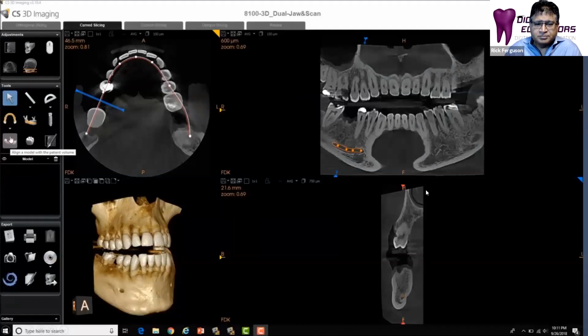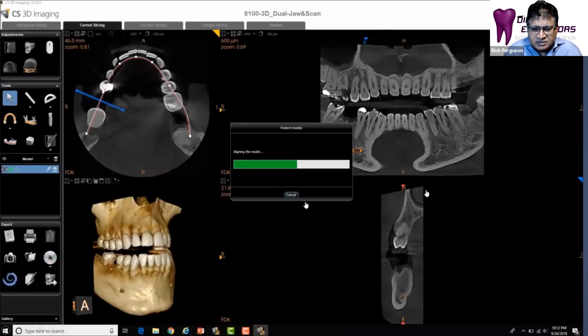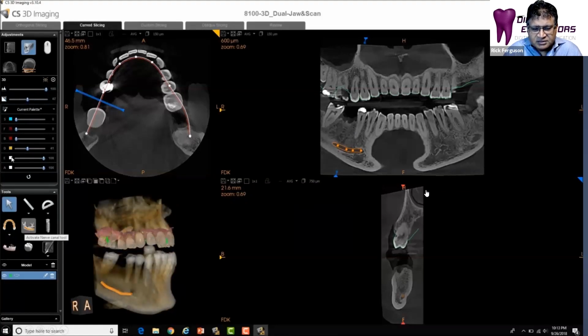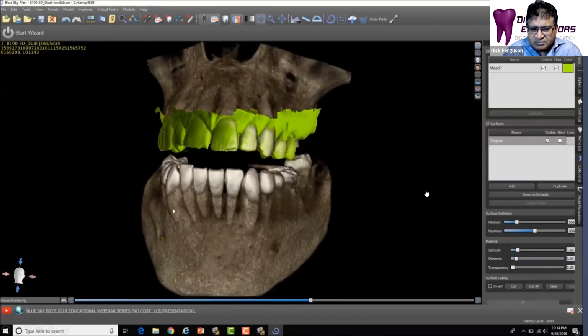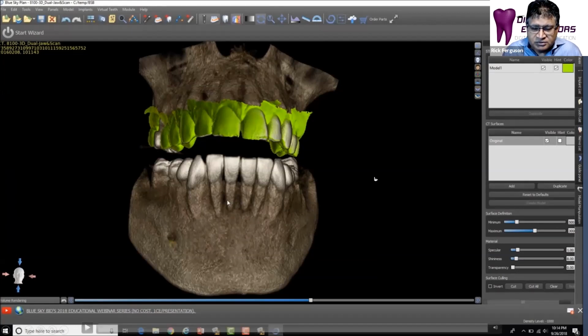All right. So as I said, the manufacturers of our equipment, such as our CBCT and intraoral scanners, have started incorporating and automating the processes. This happens to be the system we have in our practice, where the manufacturer of the CBCT has automated the alignment of the intraoral scan with the CBCT image, so that we just have to click, one click, and it will automatically merge the two images together. And then we can click on another button and export it directly out into the implant planning software, in this case, Blue Sky Plan. So that's built into the CareStream workflow.